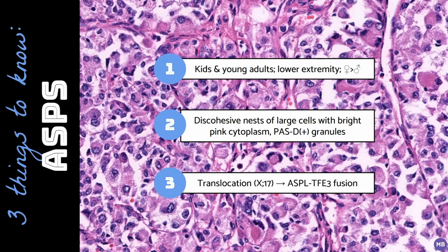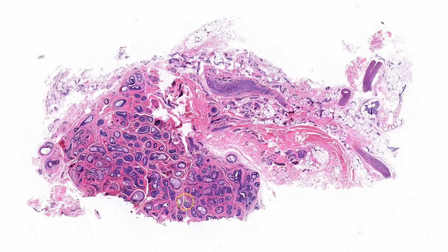Fortunately, these tumors are negative for melanocytic and neural markers, such as S100, SOX10, MART-1 or Melan-A, and HMB45, which excludes potential histologic mimics such as clear cell sarcoma, melanoma, granular cell tumor, and PEComa.